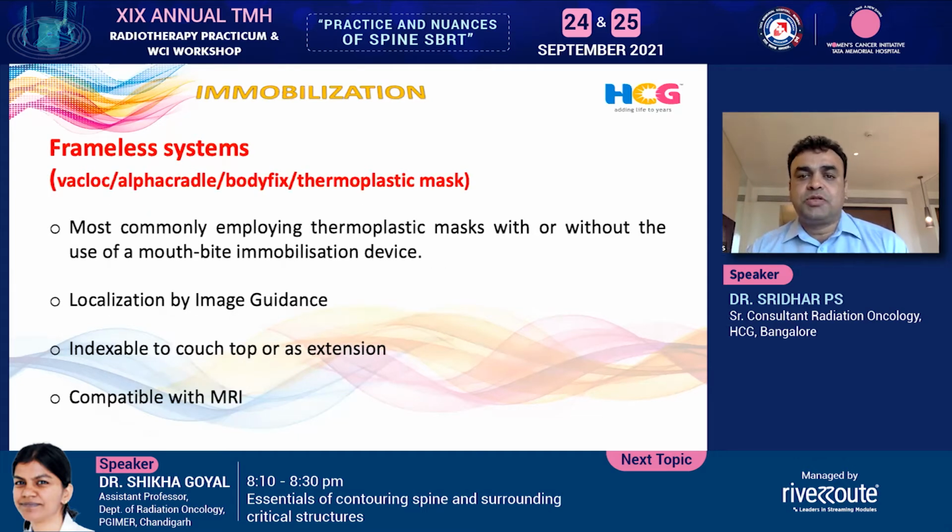Frameless is what we usually use nowadays. It may be Vac-Lok, Alpha Cradle, BodyFix, or a thermoplastic mask. Everything comes with pluses and minuses. I always suggest as little as possible, for the comfort of the patient. The Vac-Lok should be good enough to consider always. There is a lot of data to say that even minimal is enough, to the extent that simple foam-based bedding should be good enough to take care, because we are using image guidance as a priority.